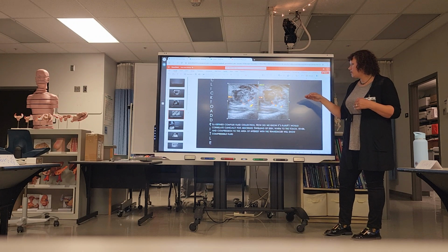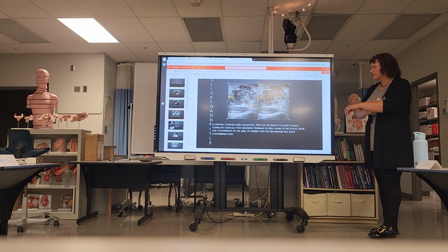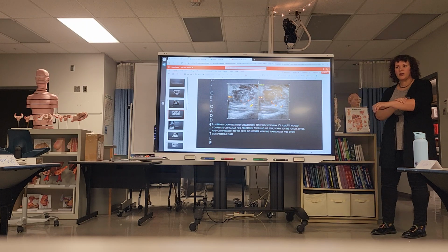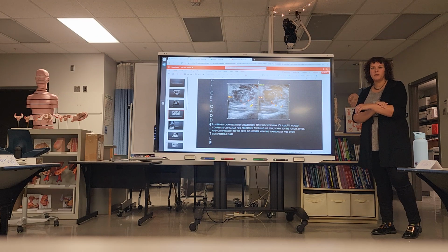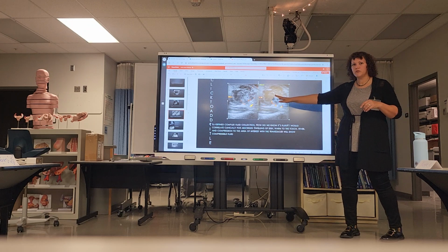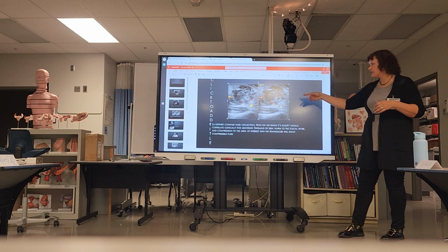So this is when you would correlate clinically. The patient is going to come in and they're going to have a spot on their skin that's red. If this is an abscess, it's inflamed. They might have a fever, and their labs are going to show a high white blood cell count. So that's why I know that this is a complex fluid collection. Some of these are hard to tell just by looking at them. You're going to have to know the patient's clinical history as well to make this call.